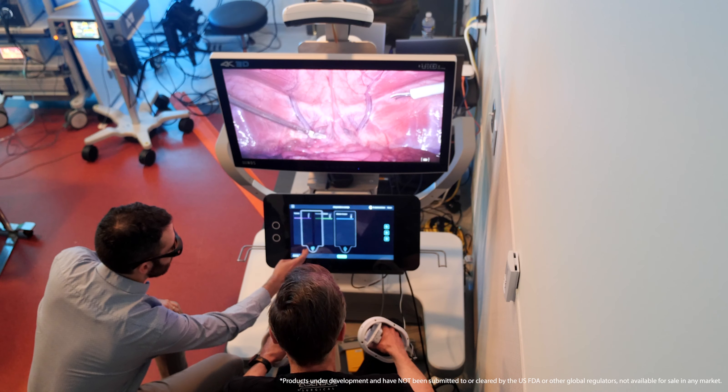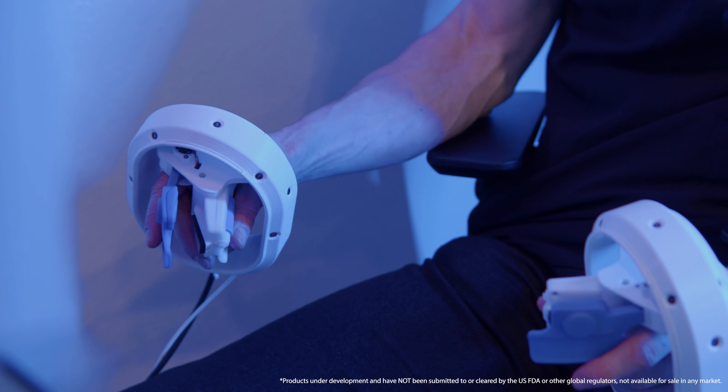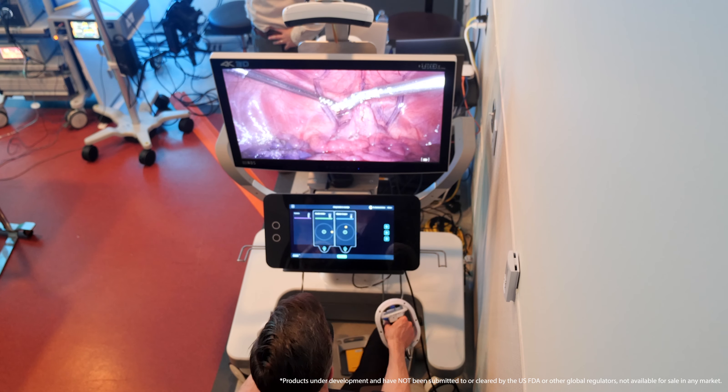The touch screen is a big advantage — you do not have to leave your position, you can stay in the same position you're already in, which is very convenient and easy to use. The open console is something I really like. The free range of motion you have with the hand pieces and the digital features that will be available in the future, such as no-fly zones, the visualization of critical structures, vessels, and nerves — this I would say is a benefit.